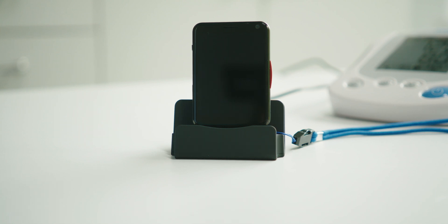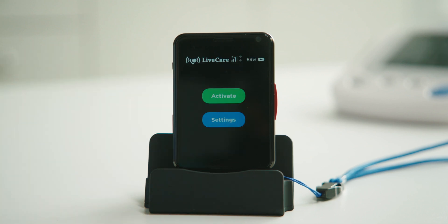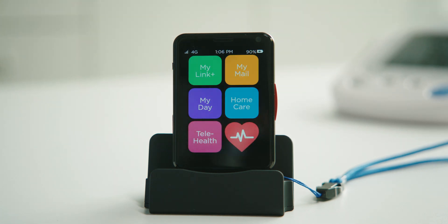Once the Link Plus powers on, it'll ask you to choose your language. Then it will automatically activate and update before taking you to the home screen. Once you're at the home screen, the Link Plus is all set up and ready to transmit your readings.